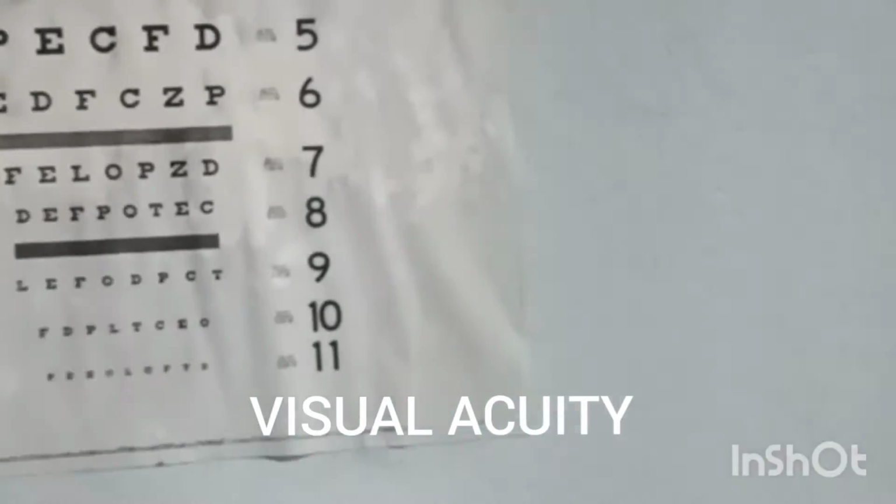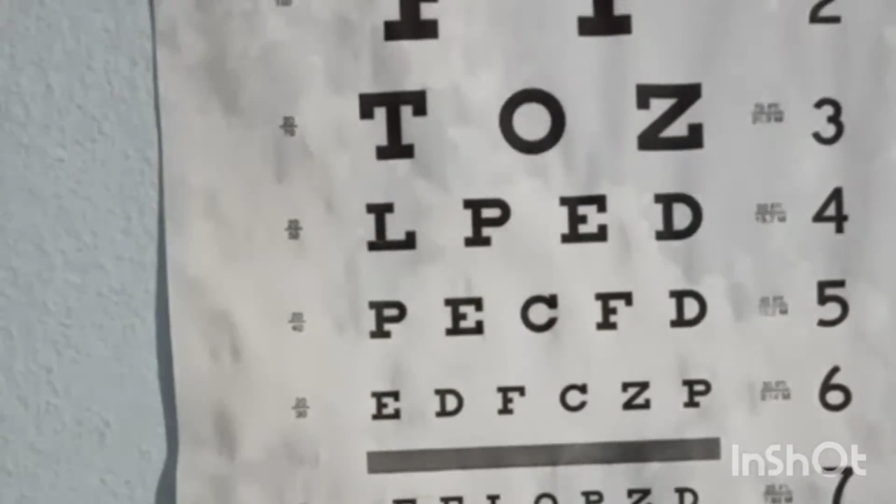To test the acuity of central vision, we'll use the Snellen eye chart. The position of the patient should be 20 feet from the chart. Now ask the patient to cover one eye with a card and to read the smallest line of print possible. A patient who cannot read the largest letter should be positioned closer to the chart.